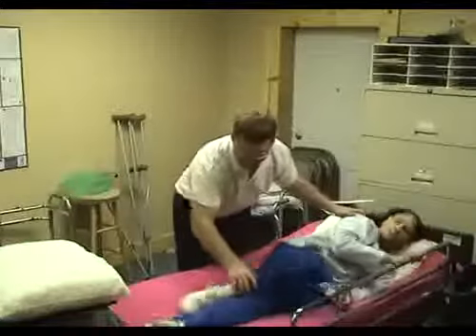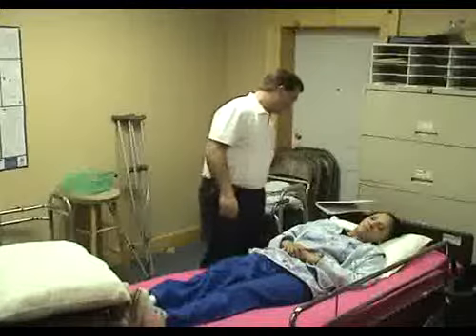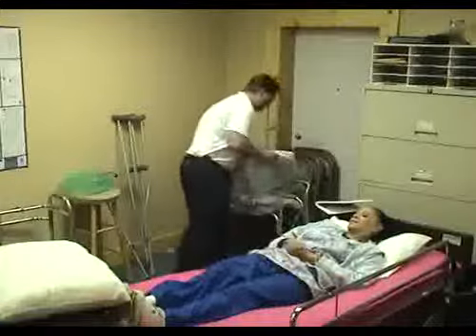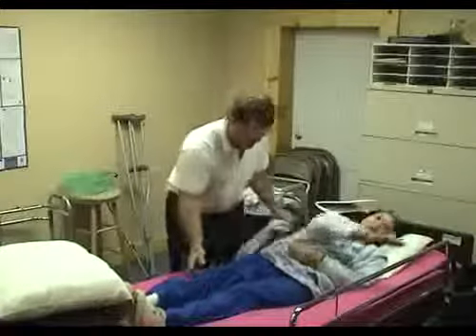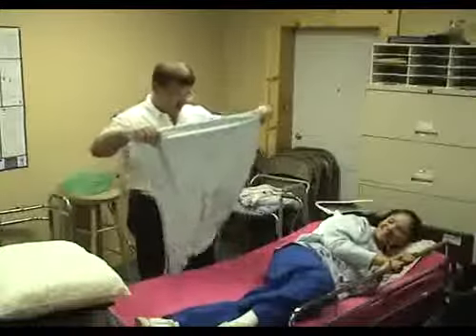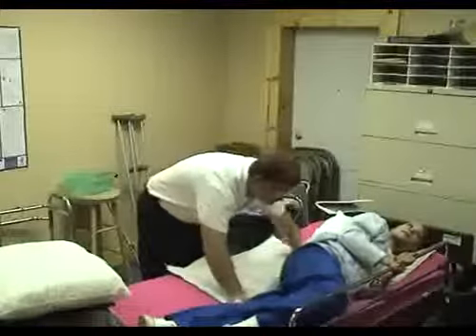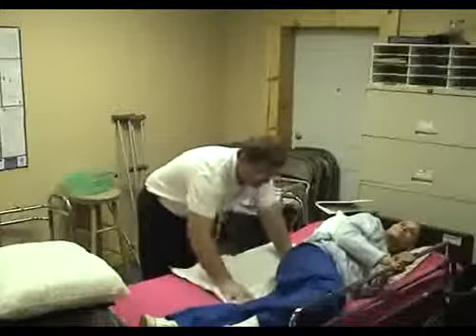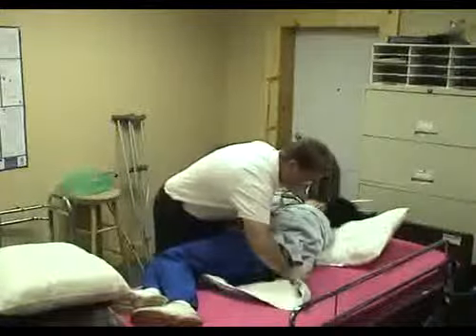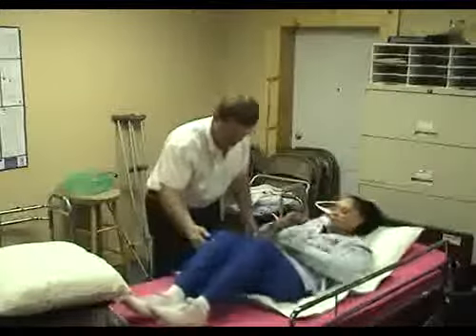Okay, come on back. Make sure that the bed rail's up opposite you. If you're using the draw sheet, you'll have to get that out and show you that one. Here's the draw sheet. We're going to roll you over again. We use the draw sheet. Okay, you can come on back. And then come this direction and slide it through. Okay, make sure there's no wrinkles in it, right?